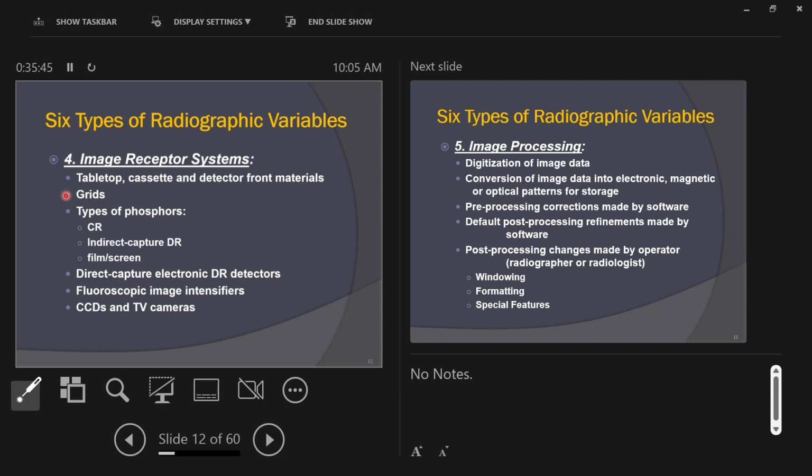When we talk about the remnant beam carrying image signal, what we didn't tell you is it also carries noise, okay? We don't really deal with TV antennas anymore, but picture the time when we did. You had a TV with an antenna, and the antenna is trying to receive a signal, right? FM radio is actually a good example too. You're listening to your radio in your car, driving here, and you drive far enough from your hometown, and your radio starts to go in and out, right? We're hearing clear sound, good signal. You got far enough from your radio station that now you're getting interference, kind of crackles in the radio, not all the sounds coming through clearly.